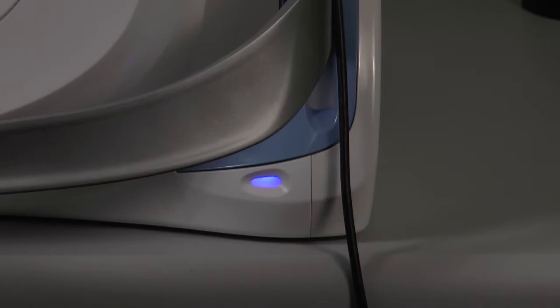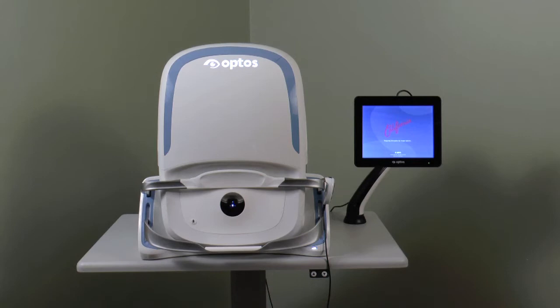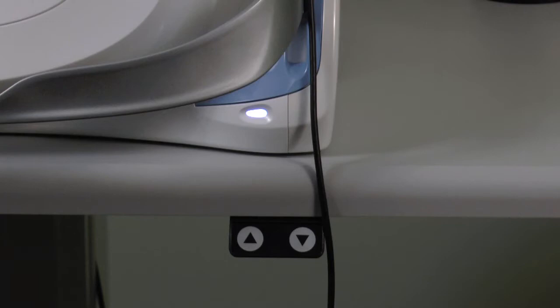While the California is warming up, the tablet will cycle through a number of screens and perform various diagnostic tests before the indicator light at the bottom right turns green, indicating that the device is ready. This takes approximately three minutes.